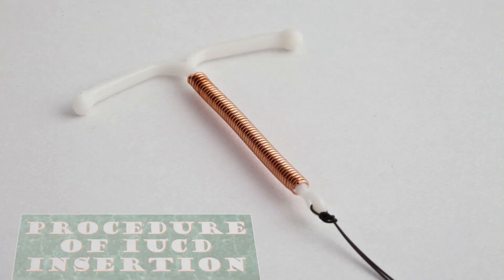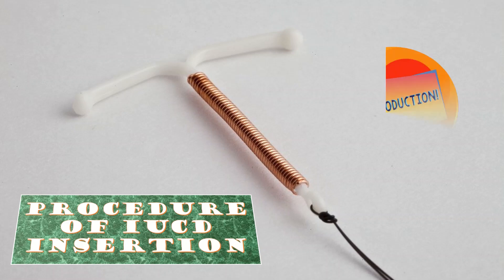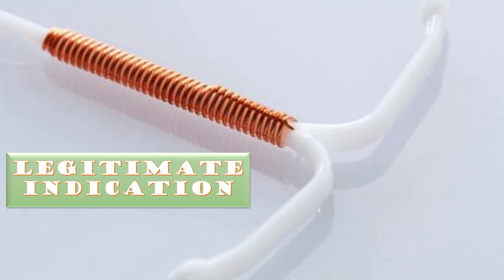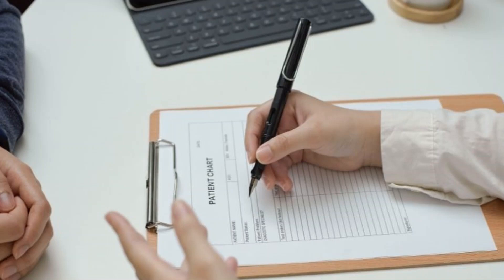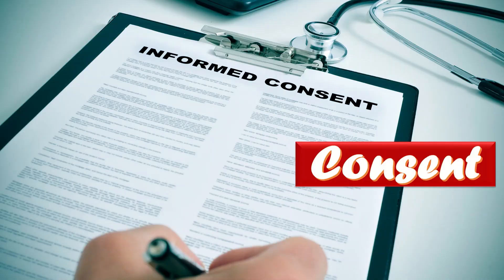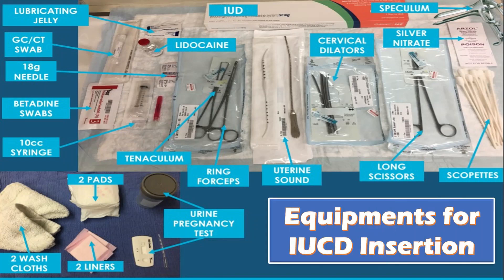For the procedure of IUCD insertion: first, I will introduce myself to the patient and take her introduction. I will make sure there is a legitimate indication for IUCD insertion. I will rule out any contraindications by taking a medical and gynecological history. I will explain the whole procedure and obtain informed consent.